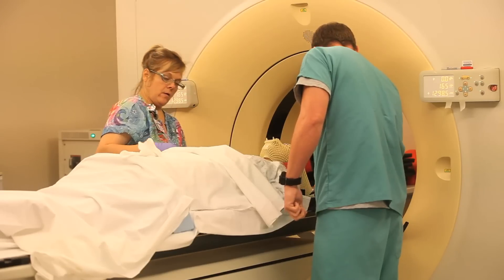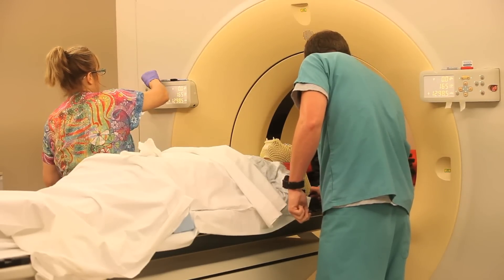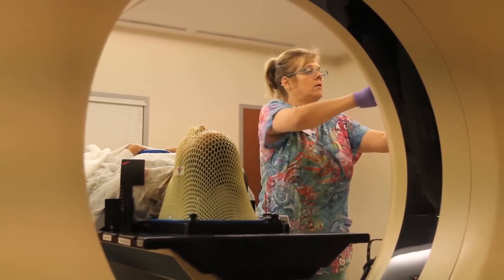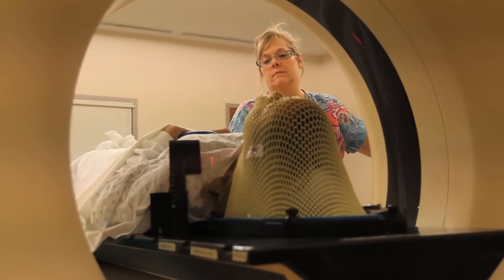Your mom and dad are right here with you. You're going to feel the table moving in. We're going to check for your straightness and then we're going to do your CT imaging — take pictures of you.